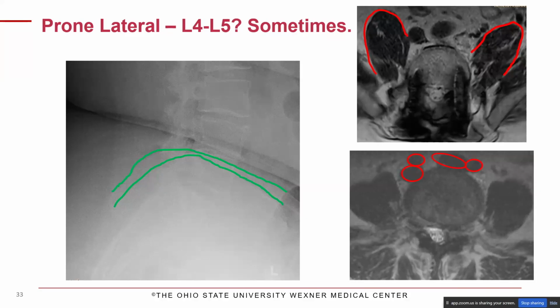Then in the bottom right, it's a reminder that closely examining the vascular anatomy is critical to prevent devastating injury. So in this case, approaching from the right side would probably be risky, just because of the positioning of this particular vessel. From a psoas approach, this is fine.